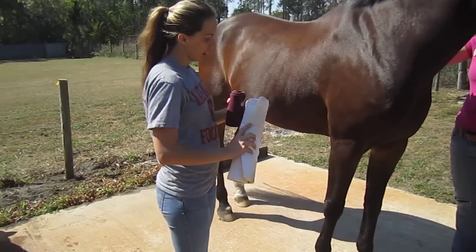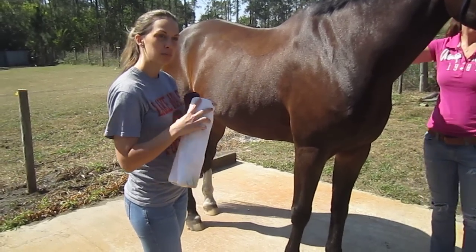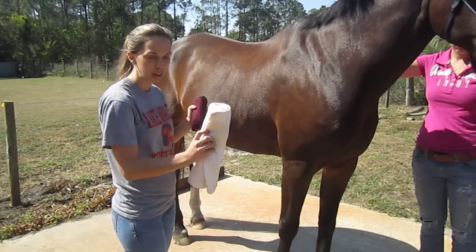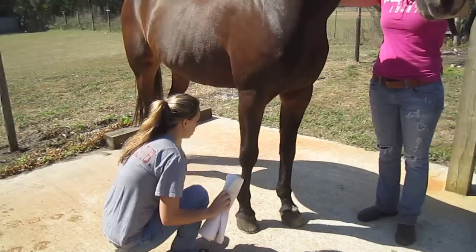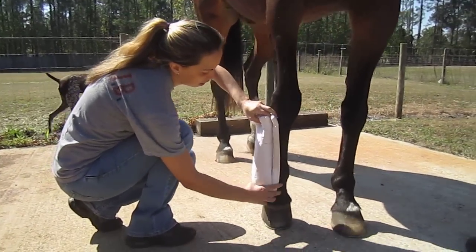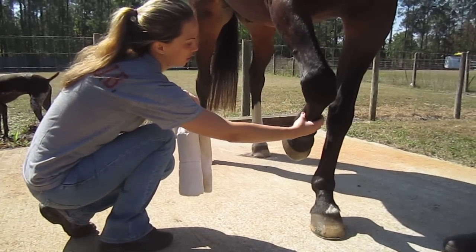We're going to apply a leg wrap. Leg wraps are meant to apply pressure to either be supportive or to protect in case you have some sort of a cut or laceration that you want to keep closed and clean. First, you want to make sure that you're rolling out so that it's easy, and you want to make sure that you're applying the pressure to the cannon bone, which is right here.